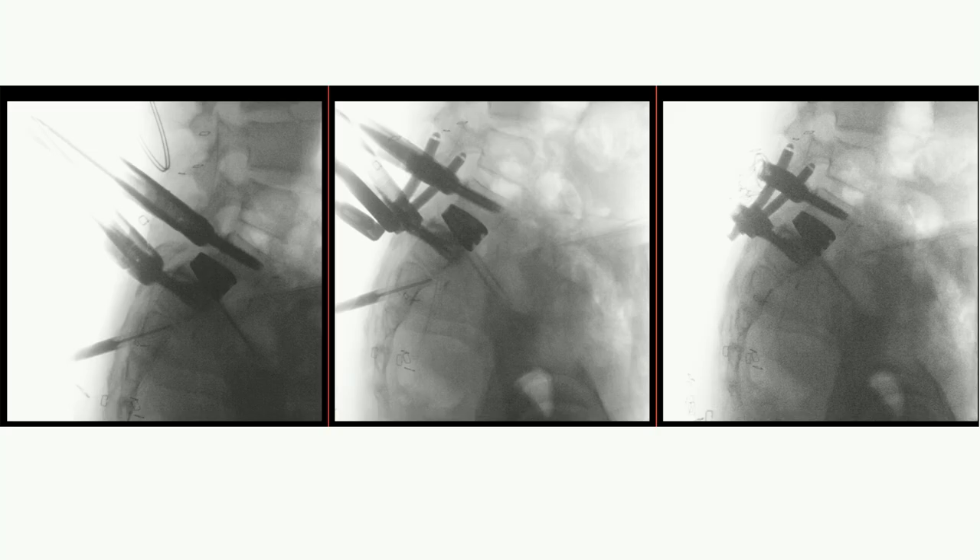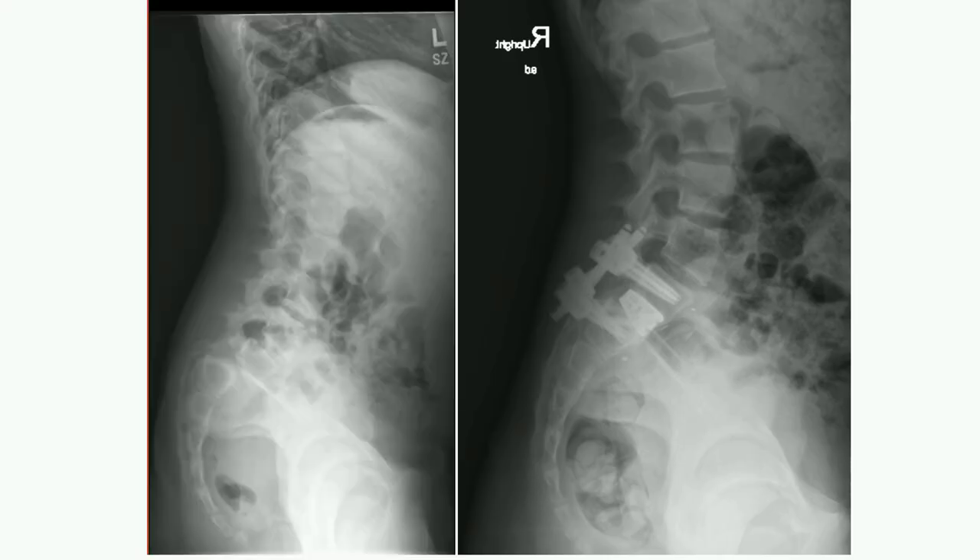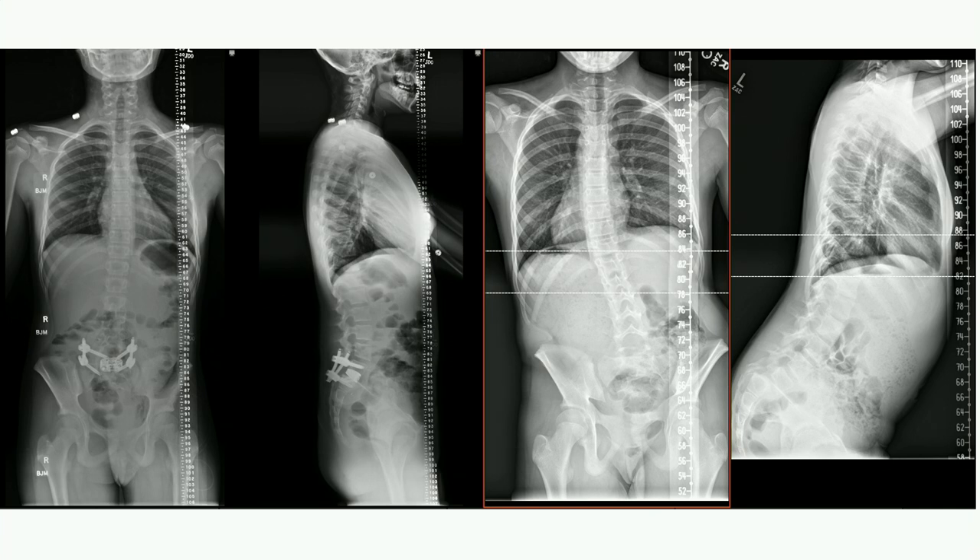Even before you place the screws, it's usually reduced to probably a grade one and a half or so. That is the approach there, and the scoliosis seemed to have mostly resolved as well.